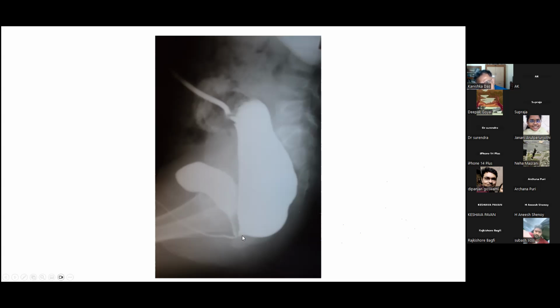And there's a sharp angulation. So again, your dissection there has to be careful. And it is low down, so your common wall is long for you to dissect. So it will be easy to get to the fistula, but there will be a long wall to dissect, right? So these are the things that you look for in a distal cologram.